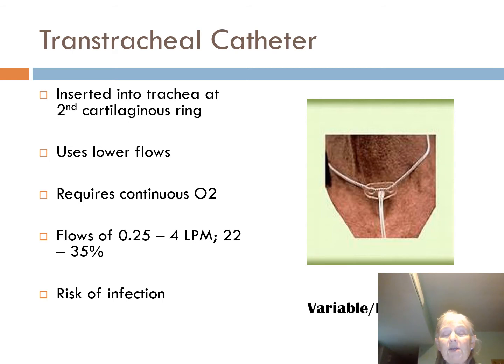People that wear this do like it because it's sort of comfortable and not glaring at everybody. Look, I wear oxygen, I wear oxygen. So some people like it much, much better. Problem you have, risk of infection, especially if you don't keep it clean. Another problem, easily to pull out. You got to be careful with that.